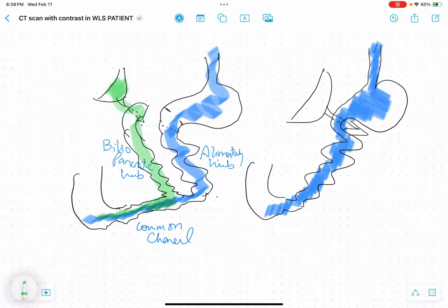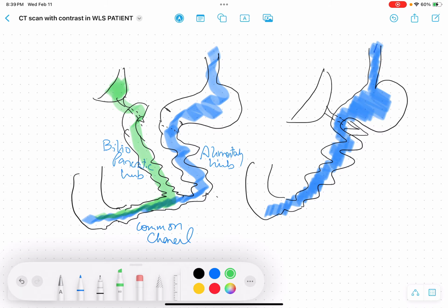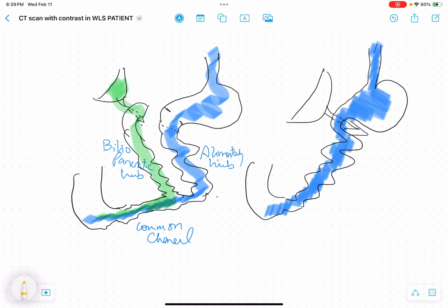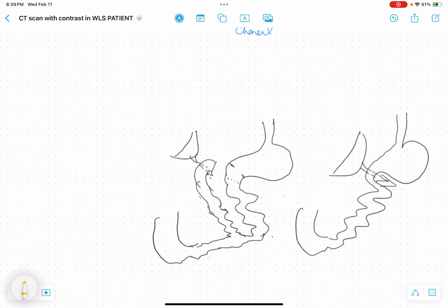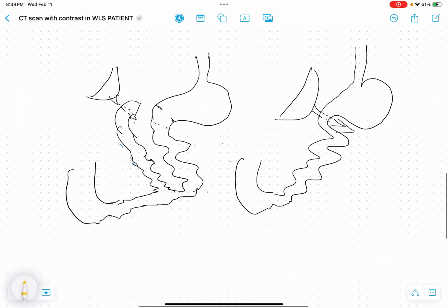So here's what happens when you have an obstruction, and why it is critical, when a patient shows up with abdominal pain, nausea, with or without vomiting, and they have had a history of duodenal switch or in fact gastric bypass, to have a CT scan with oral contrast, which should be gastrografin. And that'll be important to appreciate.